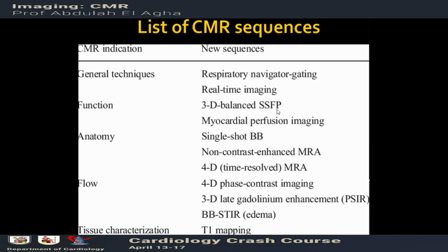الإندوكارديال ديلينيشن. الإندوكارديوم واضح جدا عن البلد. فلما أجي أقيس دايمنشنز أنا واضح جدا إن ده السبتم بالظبط زي ما هنشوف في الحالات دلوقتي. This is the septum. I will not include paraseptal shadows، مش هدخل أي حاجه ثانيه. This is only the septum. So spatial resolution is very high. دي أحد الميزات بتاعه الكارديو.